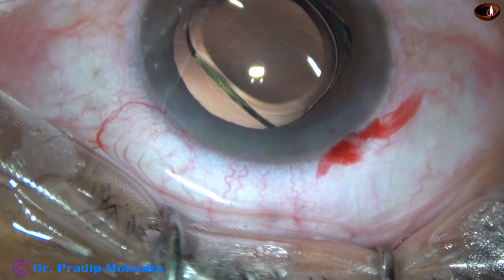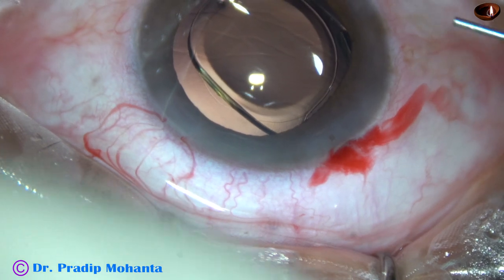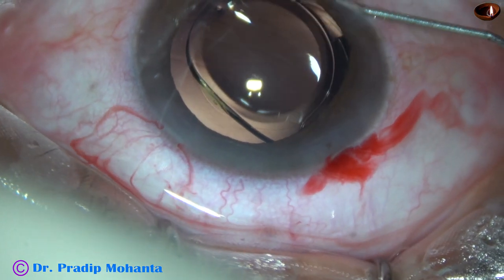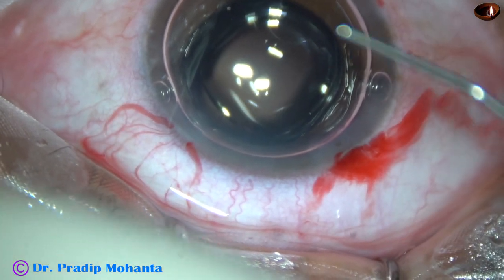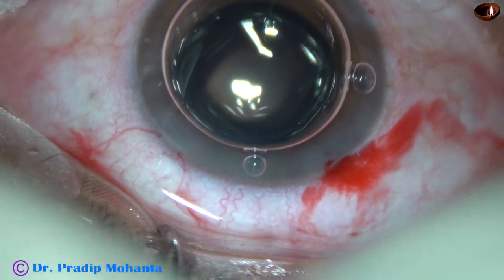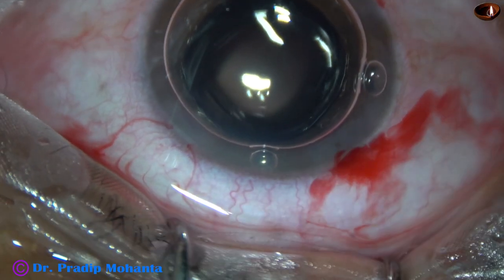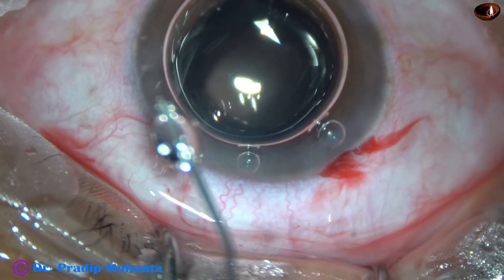Now the anterior chamber has become shallow. So, to maintain the anterior chamber at this time, we can inject an air bubble. Now, the side ports are closed by hydrating the corneal stroma.